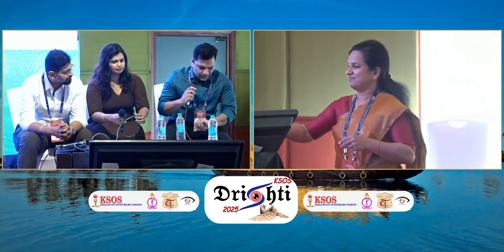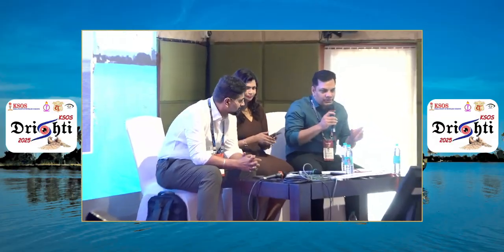Thank you, ma'am. So I think another 1 more minute for discussion. I just ask one question to Dr. Rahul. So you also discussed that pigmentation. So let's say an asymptomatic patient comes for a routine exam and then you see one CHRPE lesion in the periphery. First question, do you tell the patient that something is there? Second, once you tell, when would you ask them to come for a repeat exam?